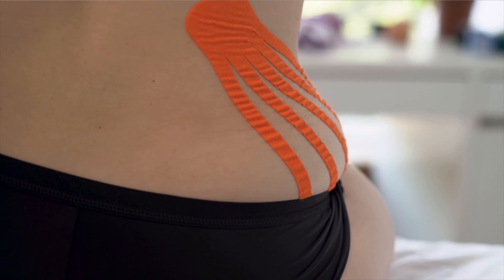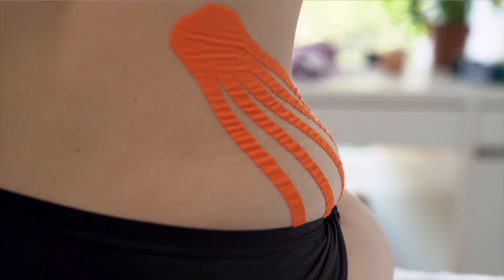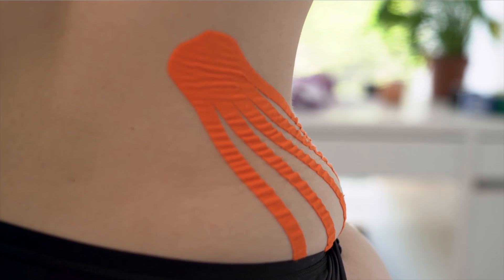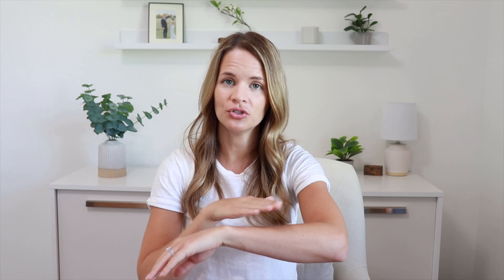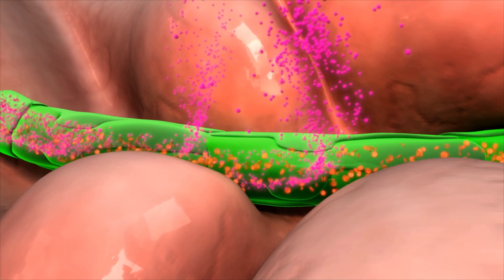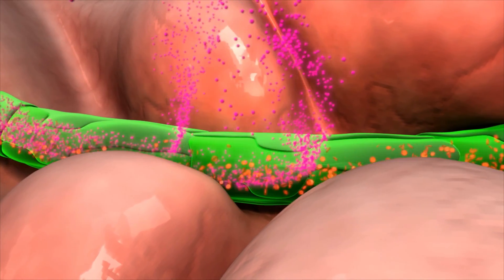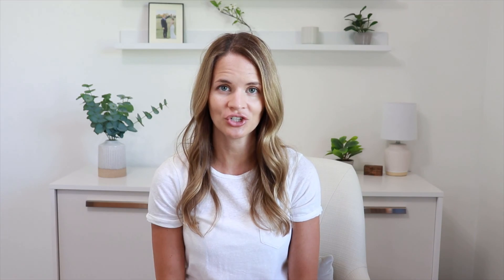So how can kinesiology tape actually work for swelling? When the tape is put against the skin, it will lift the skin up a little bit and there will be space in between the skin and the tissues below. That space changes the pressure gradient in that area, and that causes the fluid — the swelling — to move into lymphatic vessels to get moving out of that area, which will help decrease the swelling and the congestion.